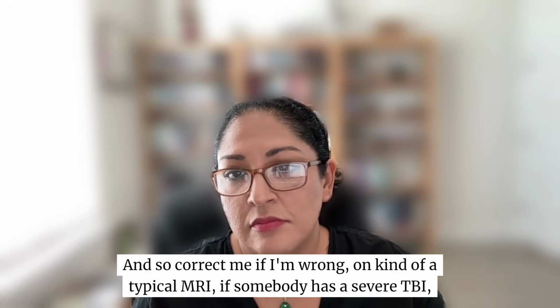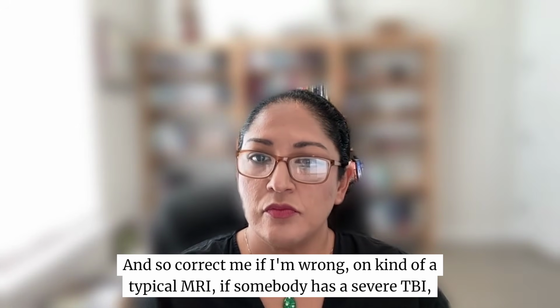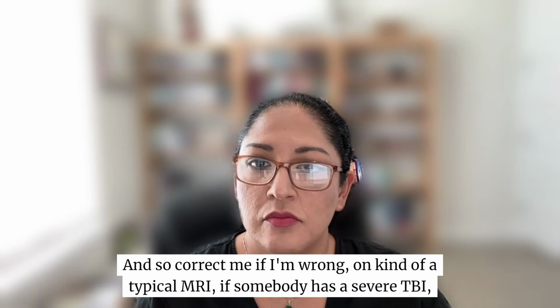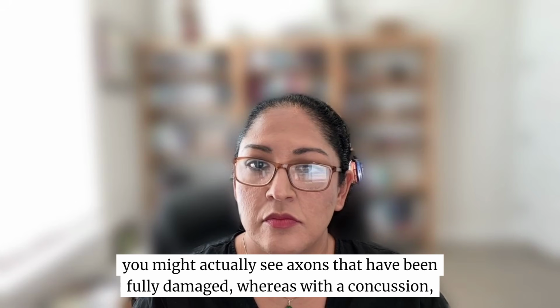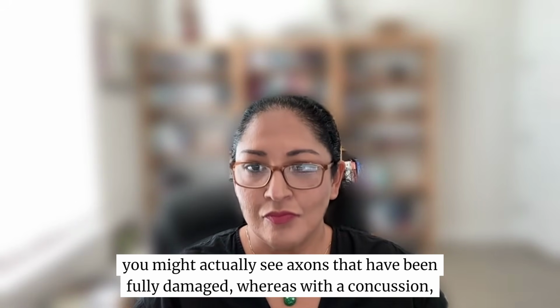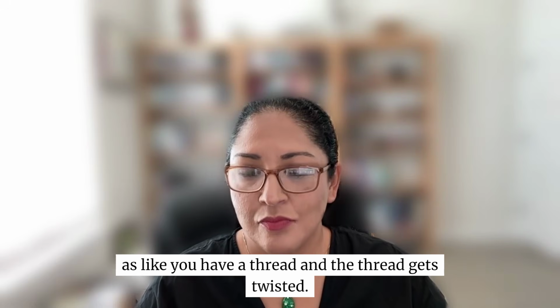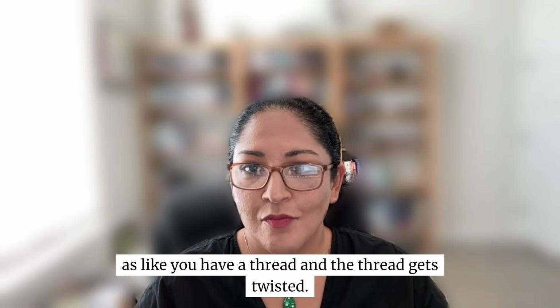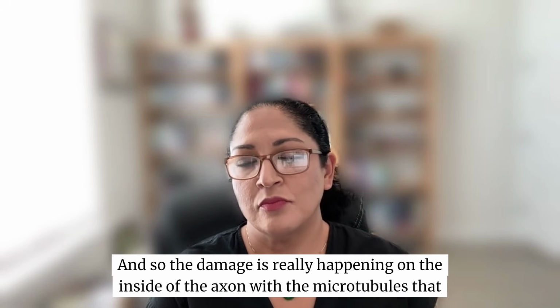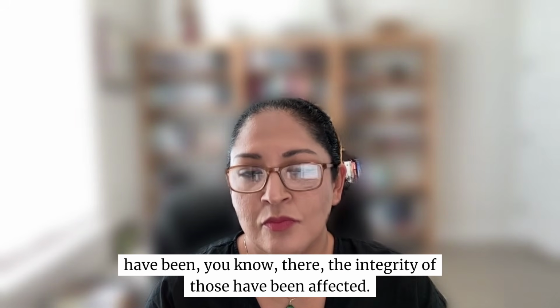Yeah. And so, correct me if I'm wrong, on a typical MRI, if somebody has a severe TBI, you might actually see axons that have been fully damaged, whereas with a concussion, there's more of, like you mentioned, the shearing force, which I think of as like you have a thread and the thread gets twisted. And so the damage is really happening on the inside of the axon with the microtubules, the integrity of those has been affected.